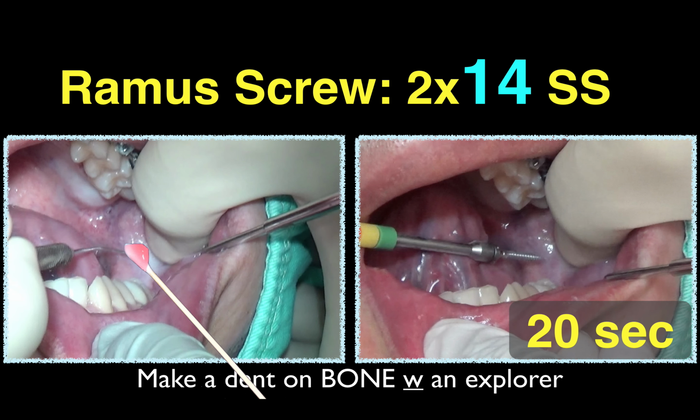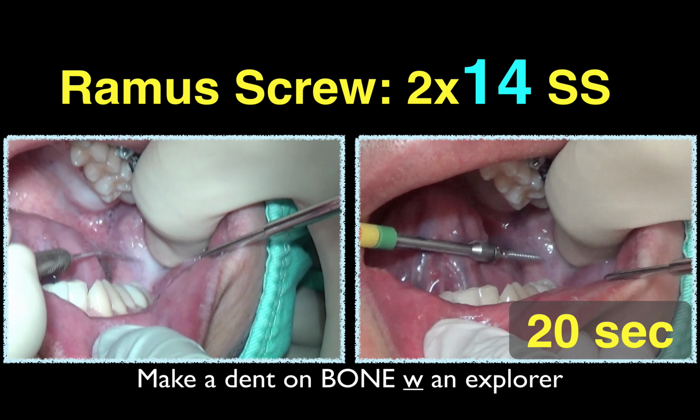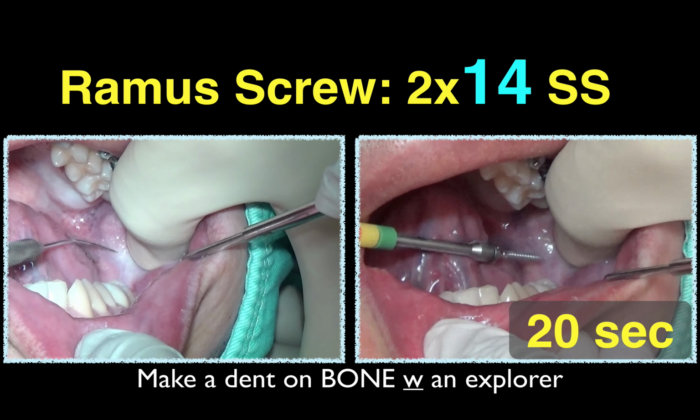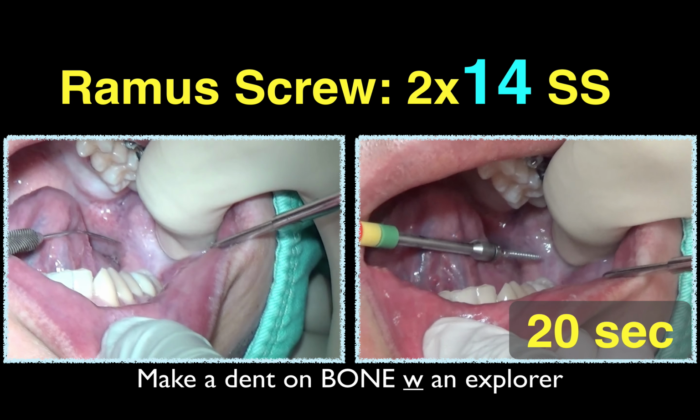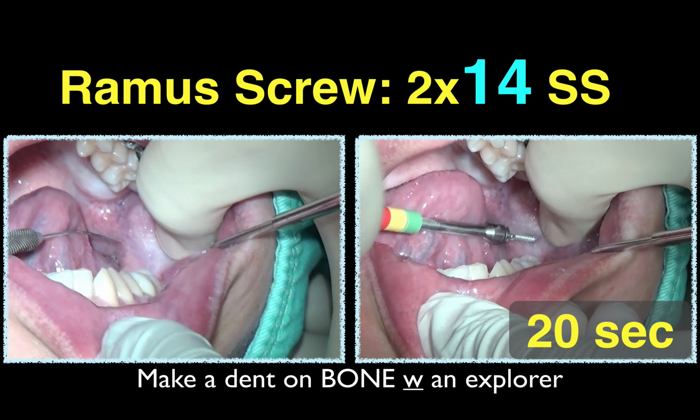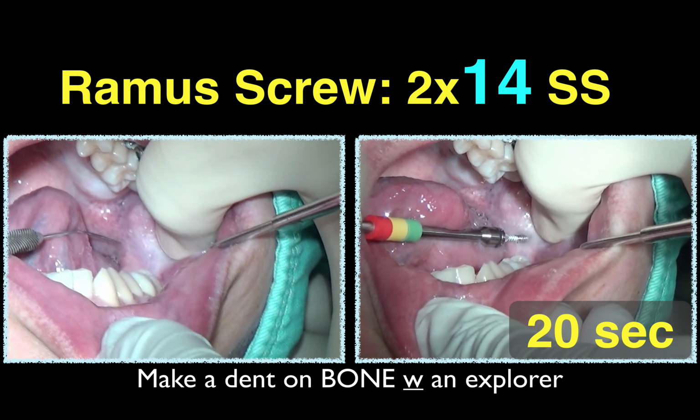And people will say, is that difficult to do? No, it's so easy. Let me show you. Before you put a screw, you really need to put local anesthesia. When I give a lecture, I forgot to say you need local anesthesia. They just put a screw and the patient will jump out of the chair. So you put a topical and then you put a local. Local infiltration should be enough. After that, you make a dent. With this dent, you follow the dent, and it's easy to put this screw. Within 20 seconds, you're done.